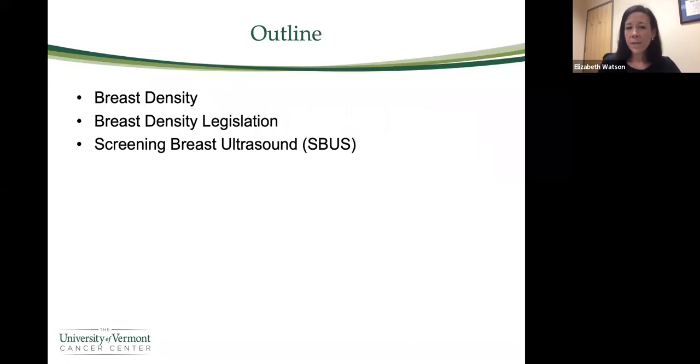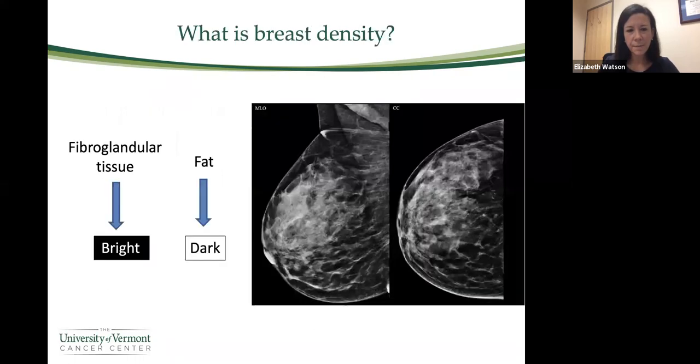Specifically, we'll aim to talk about breast density. What is it and why is it important? We'll talk about breast density legislation, which we've seen sweep throughout the country. And we're also going to talk about screening breast ultrasound, which you'll see me abbreviate throughout the talk as SBUS, in case you wonder what that means.